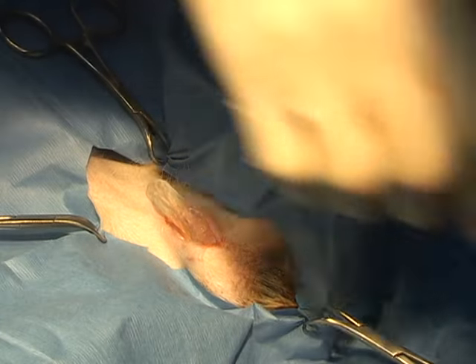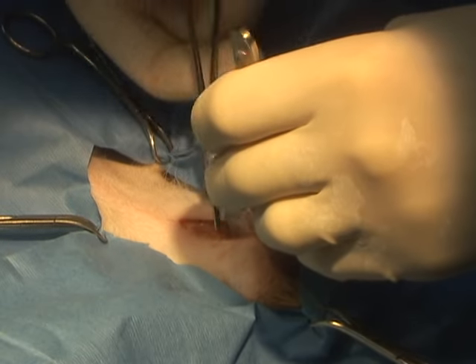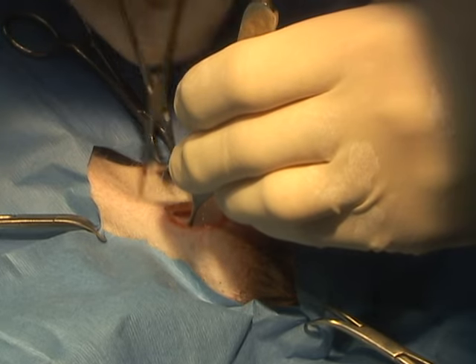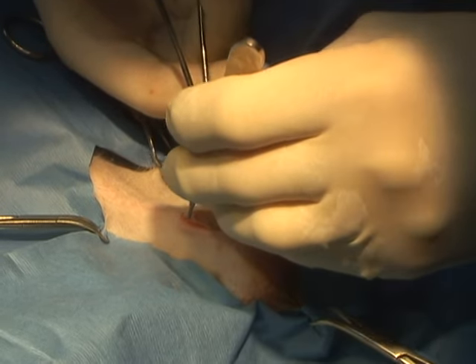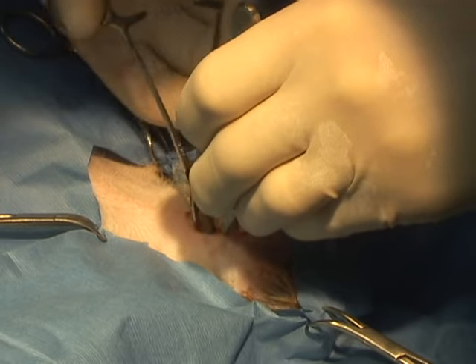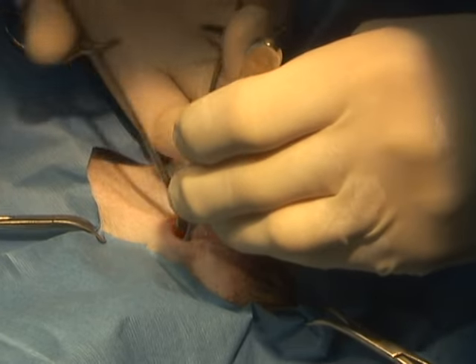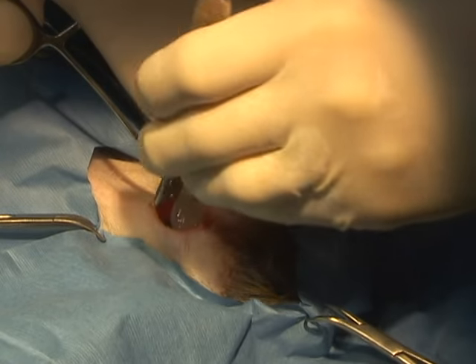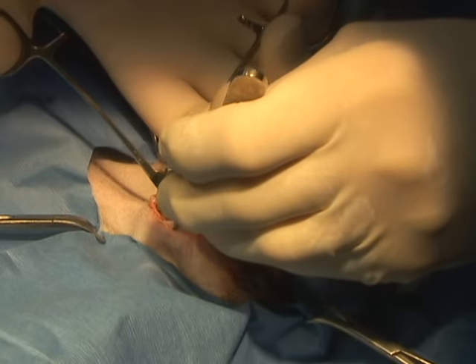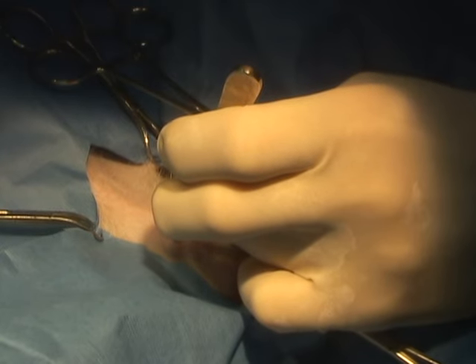And it does appear to fit quite nicely. The epididymis we had to dissect down cranially and dorsally in that position towards the inguinal canal so that the epididymis would go in. The opening had to be changed just a little bit to accommodate the epididymis. In a normal procedure where this is placed inside the vaginal tunic, it's a very quick procedure, and this just makes it a little more difficult because we just didn't have a place to put everything.